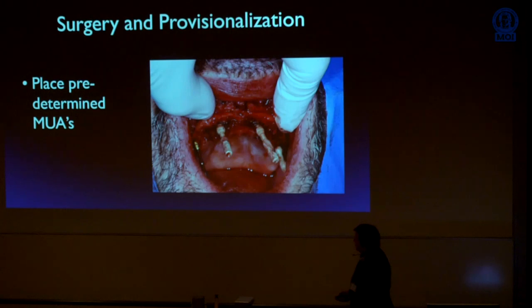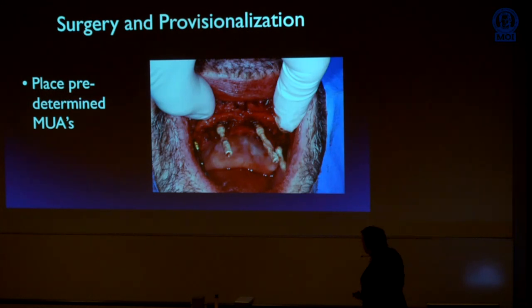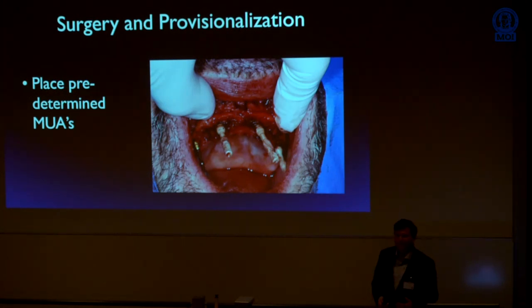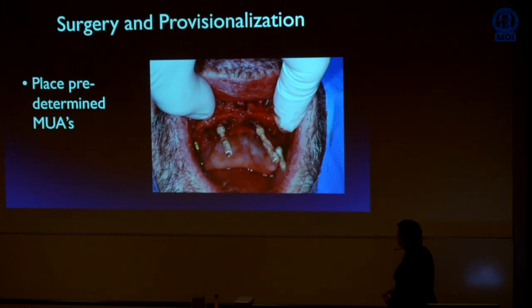This case was done with MIS C1, which again is also a very good implant, and they've got a great multi-unit abutment level scan body. So these are the carriers for the multi-unit abutments. It's very reassuring to see how parallel they are, because I've been on the other side of the fence where I've had them not so parallel. And this, I find, has worked very well in my hands.